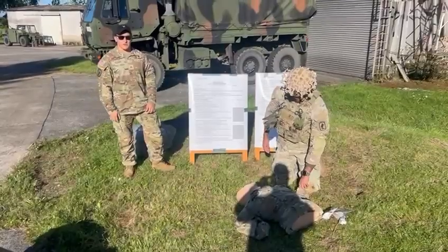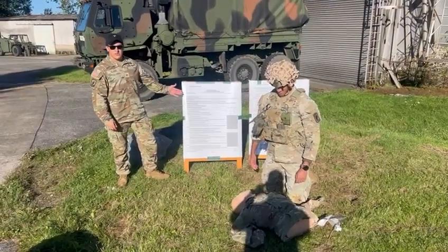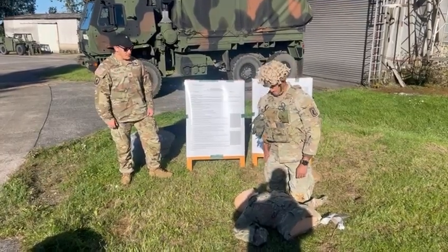Alright, good morning. I'm Sergeant Taboo. With me, I have my demonstrator, Sergeant Jishnu. Today we will be demonstrating T3 of EFMB, which is Respiration Management. Your first step in respiration management is to take BSI precautions.